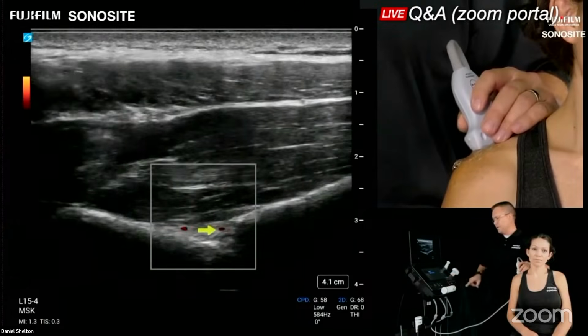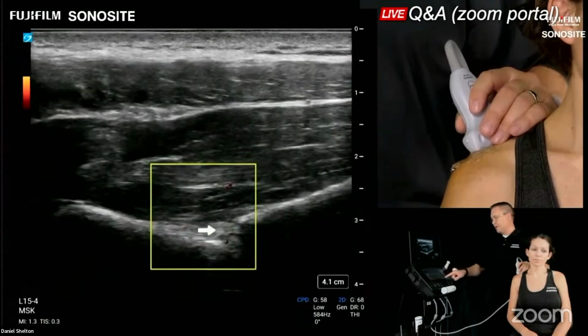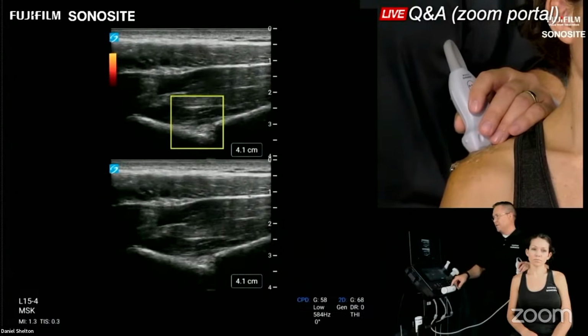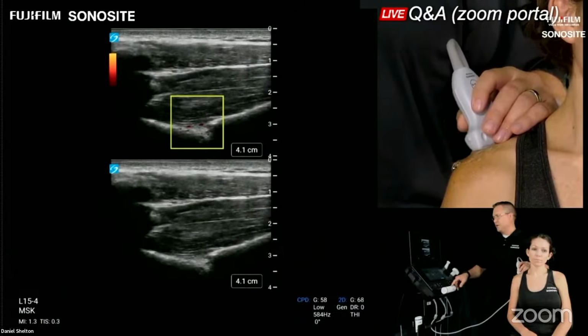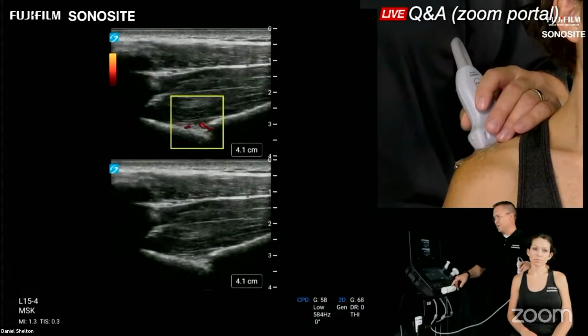If you're doing a deep procedure, this is also a good time to activate the color compare feature on the Sonosite PX. I'm going to select top bottom, so I activate the entire transducer, but here you could drive your needle in real time and see where the color was on the screen, indicating where the artery is versus where your needle might be in grayscale, so that the ROI box and any flash artifact that's showing up is not showing up in your image on the bottom.